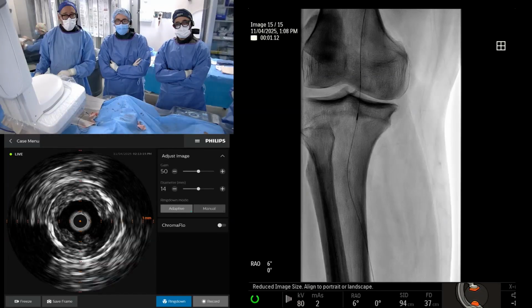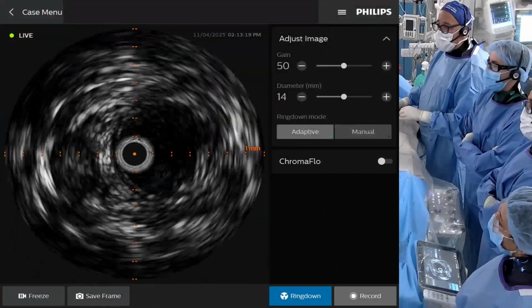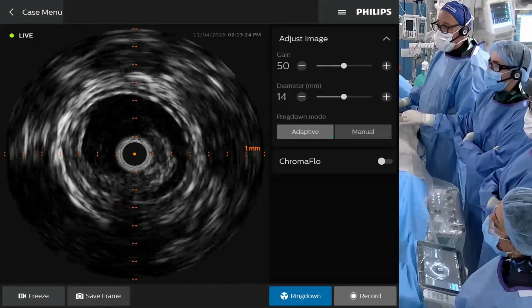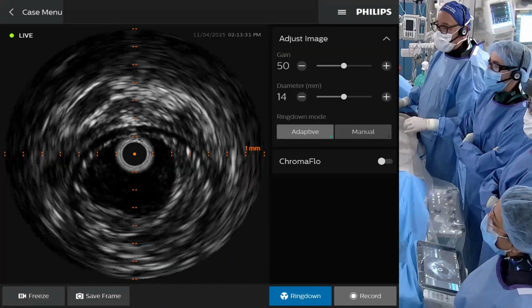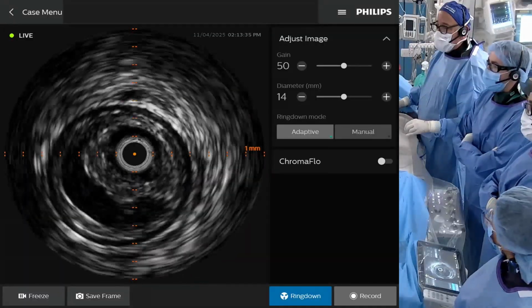Jay, were you going to make a comment? Yeah, I mean, based on the IVUS, I think we're pretty convinced that there's probably some thrombus down there as well. So there's probably some luminal thrombus that may have embolized with the balloon inflation. Pat's comment about using 6X, I think would be pretty nice here. It should cross and try to aspirate that material out. And actually, the rest of it may look better as well with some aspiration.